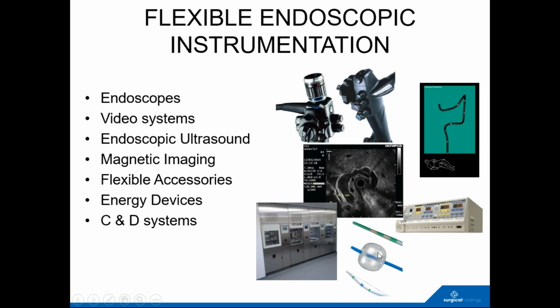There are flexible accessories, weird and wonderful instruments for grasping, cutting, dilating, and energy devices ranging from complex diathermy to lasers, and then cleaning and disinfection systems. So there's an awful lot of instrumentation technology surrounding this.